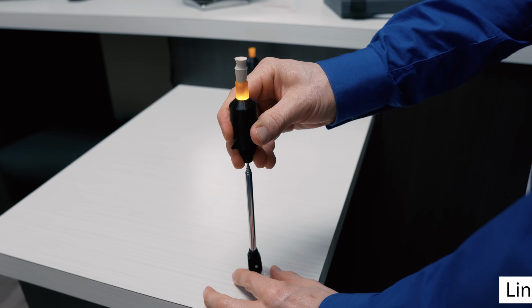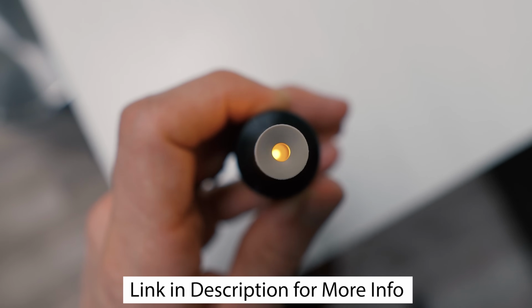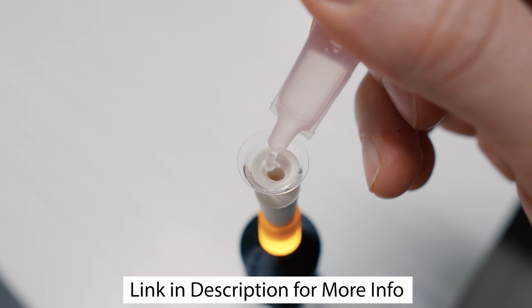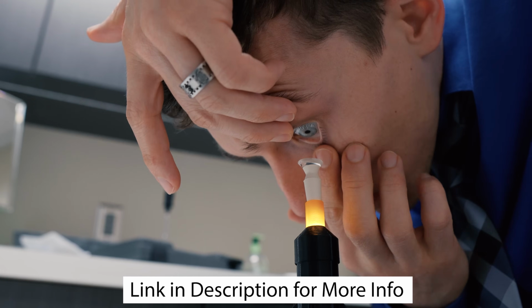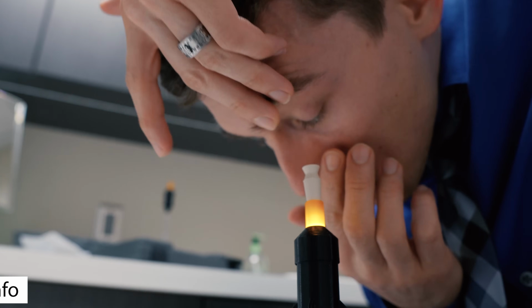If you do find it challenging to hold both eyelids open with just one hand, like maybe your eyelids are just too strong, then perhaps consider using what's called the S5 inserter. This is a special type of lens inserter that will hold your scleral lens for you and suctions onto the counter. Then you can hold both eyelids open with both of your hands, and slowly dip your eye into the scleral lens, having it suction on.